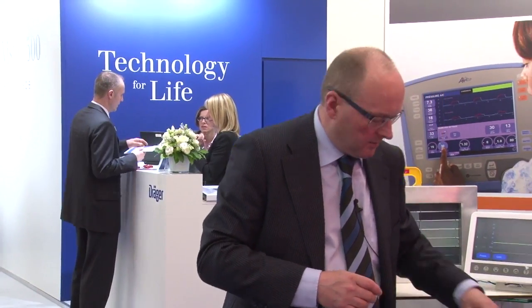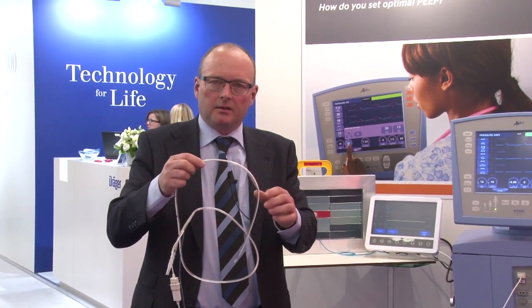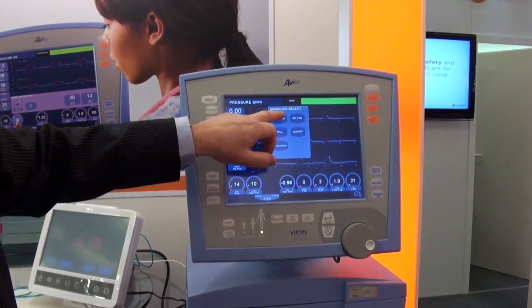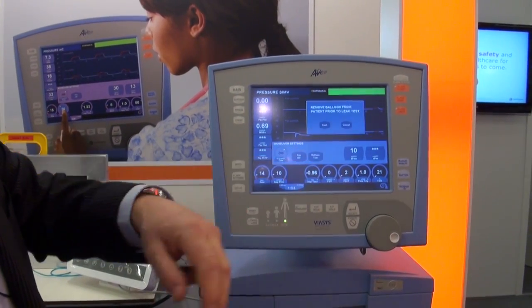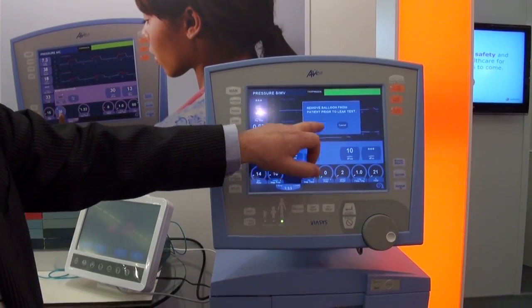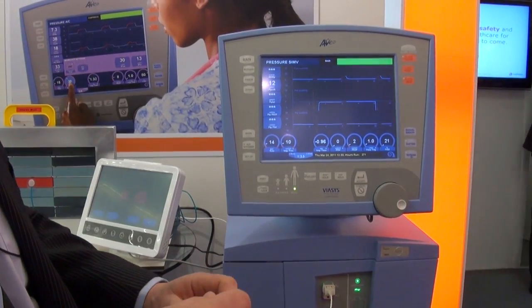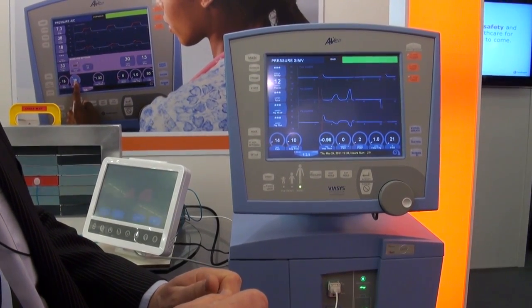Well, it's not that difficult. This feeding tube has a balloon on it. By placing the feeding tube, the balloon is already in the esophagus. The only thing you have to do is tell the machine to start measuring the pressure. The balloon is in place and you say to the machine 'start.' I can place the balloon inside the patient and then by pressing this contact the machine will inflate the balloon a little bit, and you have a pressure in the esophagus.